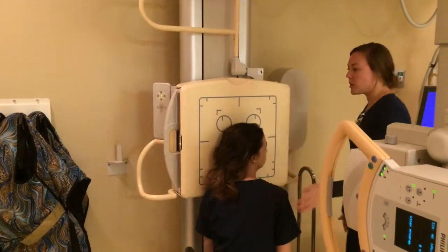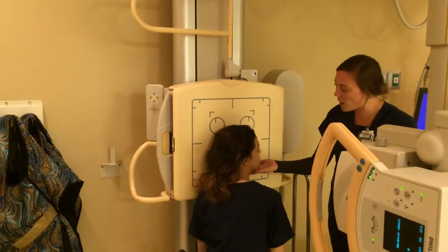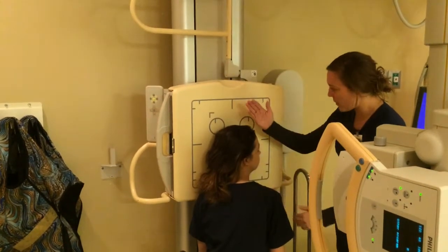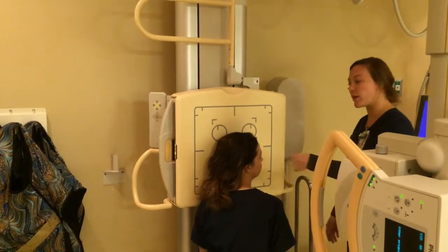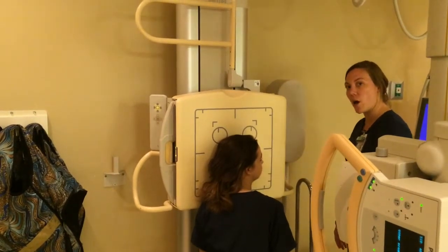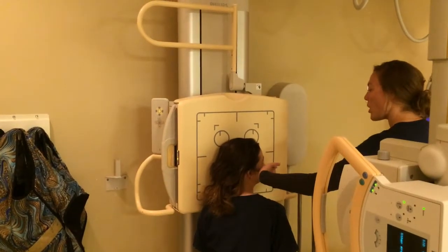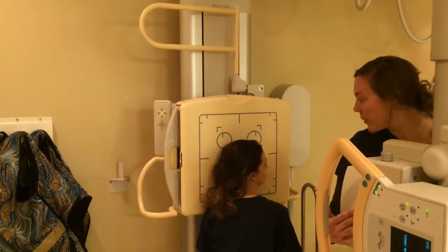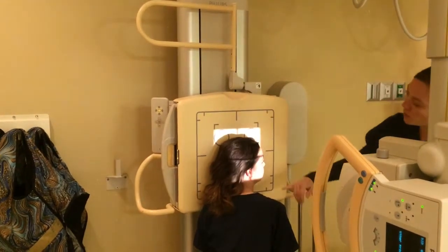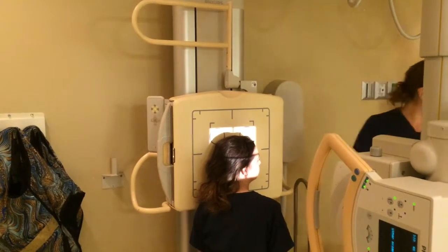So our patient is sitting in a lateral position, head up a little bit with the MSP parallel with the wall bucky, the interpupillary line perpendicular to the IR, as well as the IOML line is also perpendicular to the front edge of the IR. Our central ray is going to be 2 inches superior to the EAM.